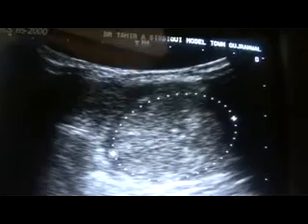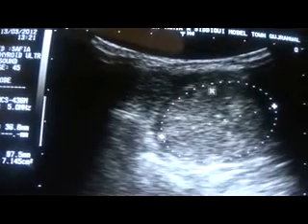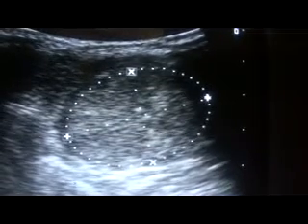Now let's see how much of the thyroid tissue is available. This is the thyroid gland — this much of the thyroid gland is visible, measuring 15.7 mm by 11.5 mm. From here onwards, from the lateral margin of this left lobe of the thyroid, a mass is seen extending laterally.